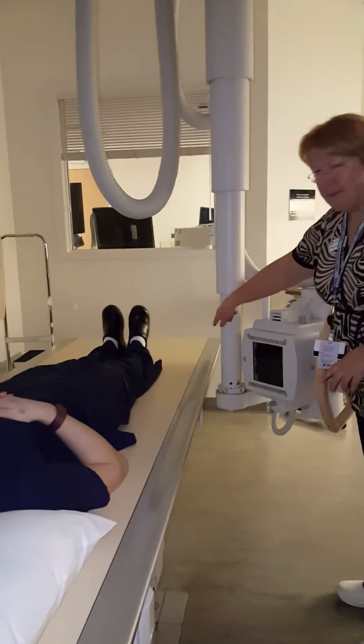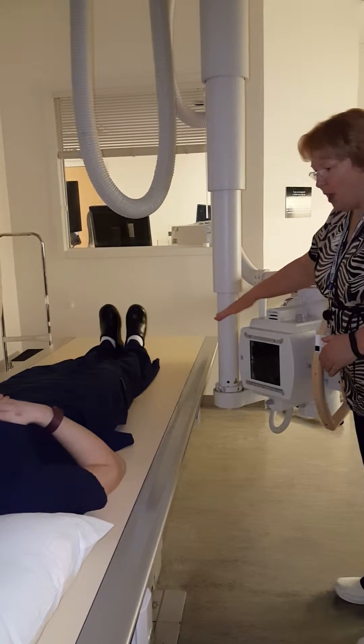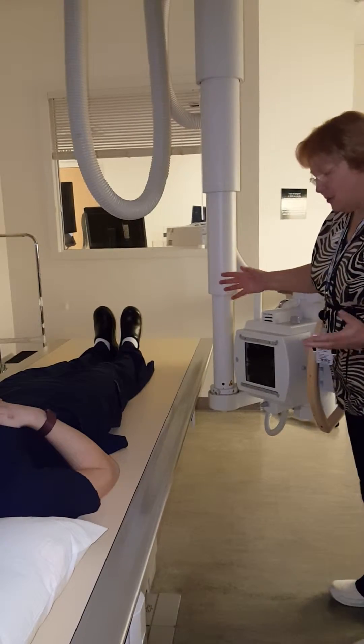Most cranes have some kind of a measurement on it that will help you get the 45 degrees, and some of them automatically lock into place at 45 degrees. Now, why do we do that?